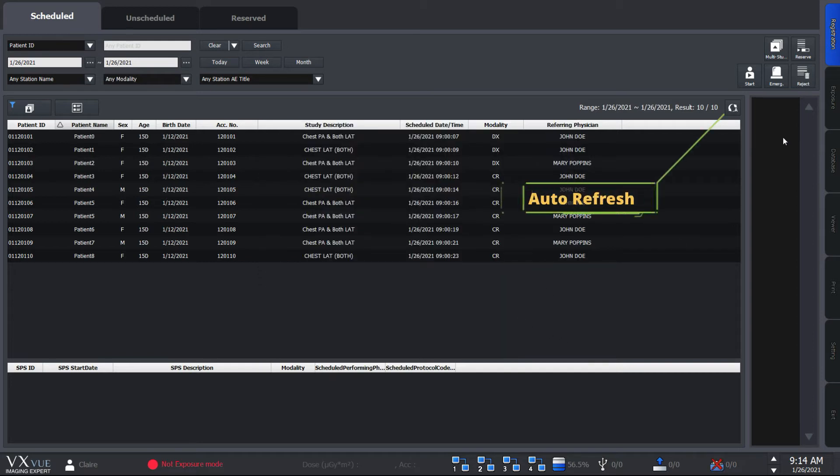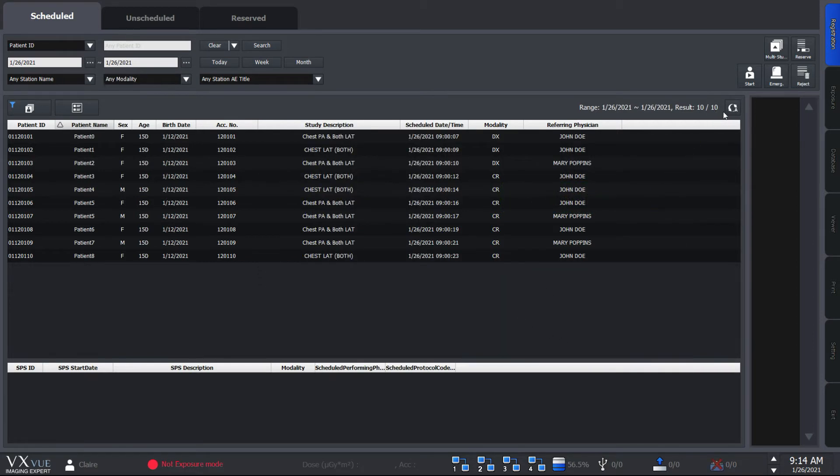Activating auto refresh enables you to update the work list automatically for a set interval. You can customize the interval at the setting mode.